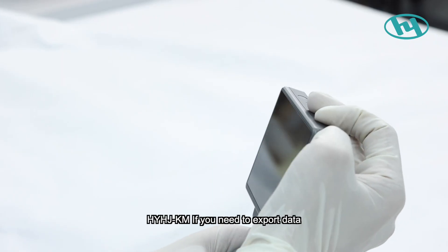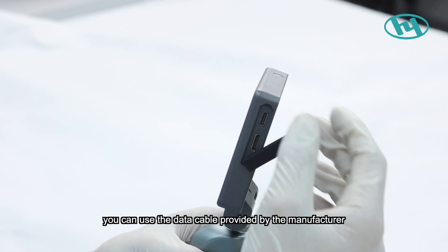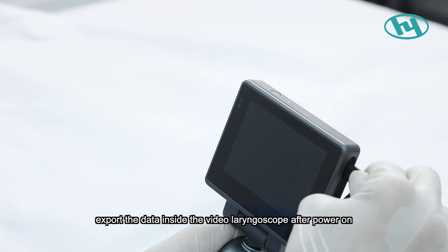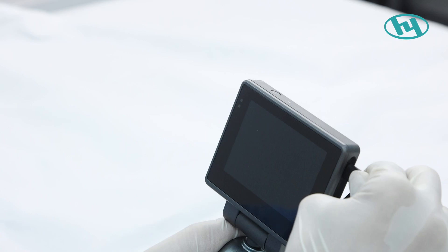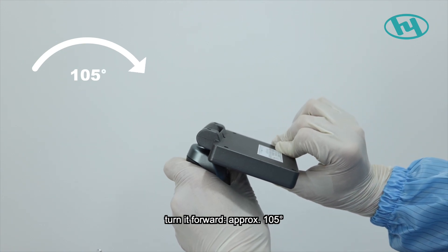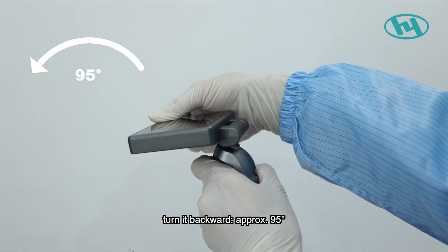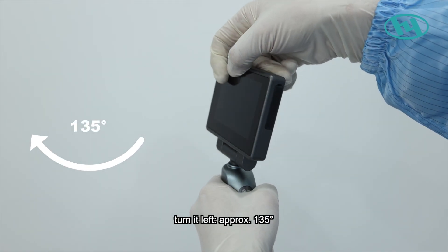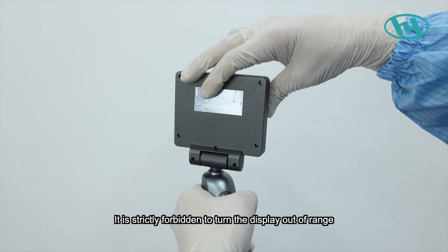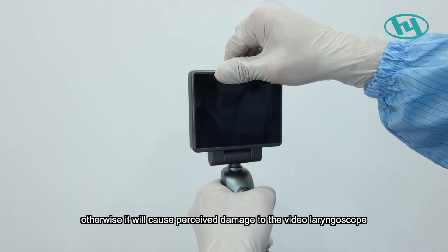Data export: Use the data cable provided by the manufacturer to connect the laryngoscope to a computer and export stored data after powering on. Display rotation limits: with the display parallel to the handle axis, it can turn forward approximately 105 degrees, backward approximately 95 degrees, left approximately 135 degrees, and right approximately 135 degrees. It is strictly forbidden to turn the display beyond these ranges, as it will cause permanent damage to the device.